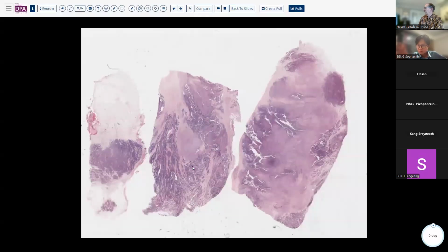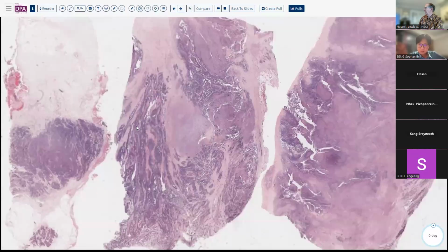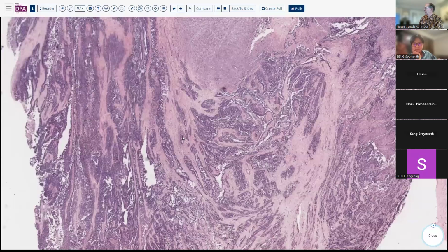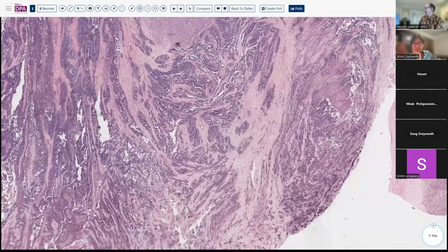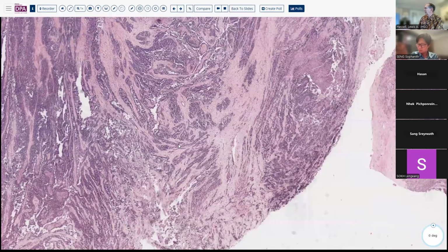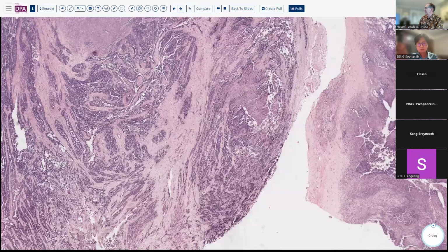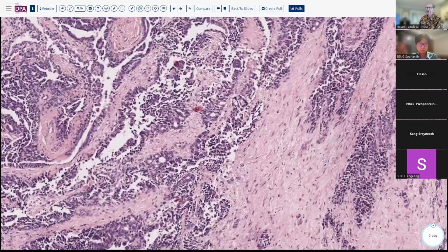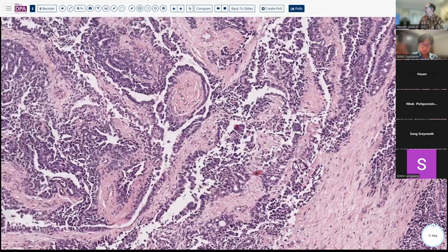Okay, another lesion that can have a very deceptive and variable appearance is this. Although clinically this is usually not a big issue, it usually presents involving the pleura, but it may invade the mediastinum and thus show up in that kind of a biopsy. So this is a nice example, and I'll let you study this at your leisure later on, of a malignant mesothelioma.